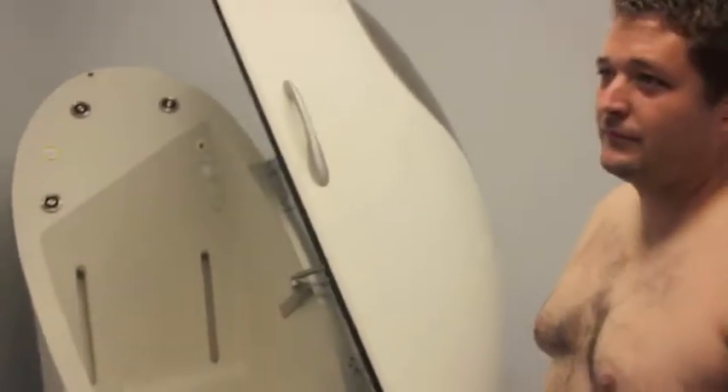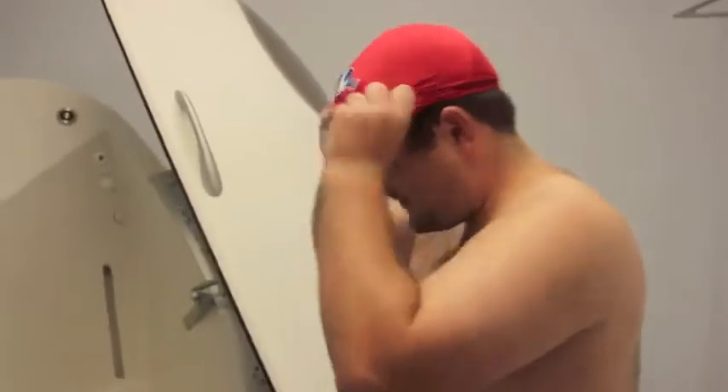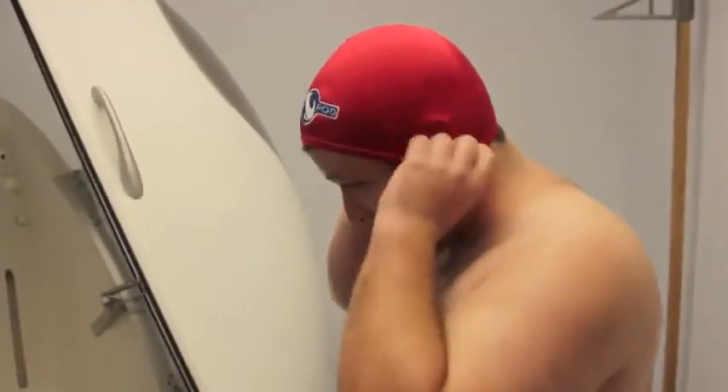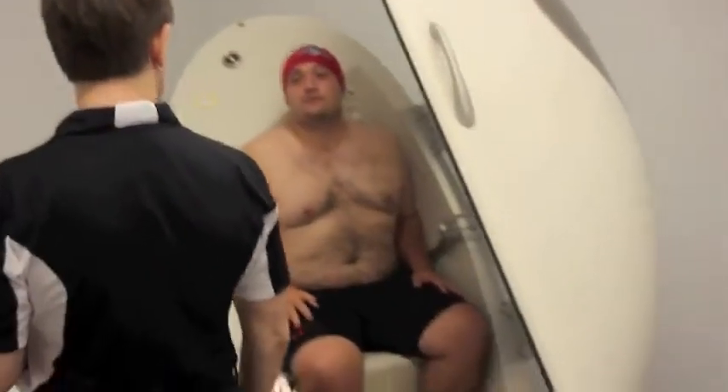Look at you — the official Bod Pod cap. This is so that you're smooth. Step in, yeah. Now you don't have to do anything but breathe normally.